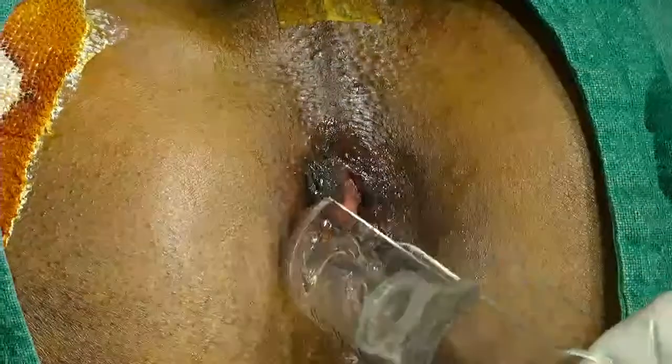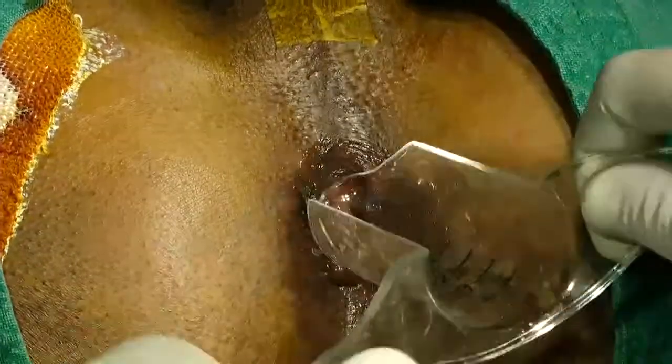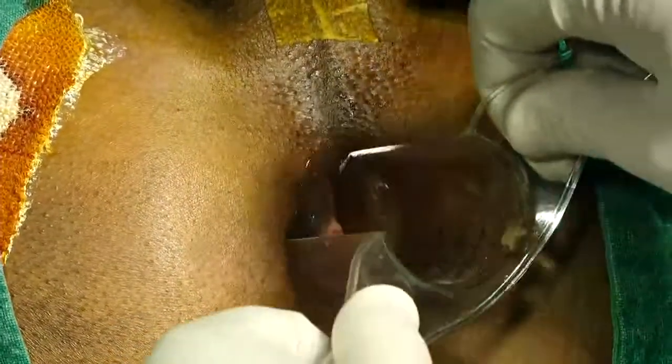So your first step is going to be to do HAL? Yeah, of course. We are doing studies in my department, a PG resident study for that, a comparative study between HAL with laser and laser without HAL, so that we will assess the efficacy and results of both procedures.